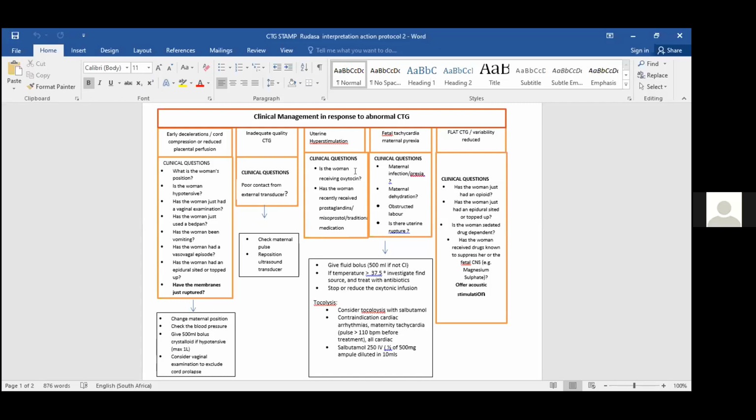Okay, and then the other frequently asked questions, things that we often discuss. People will say, okay, Dr. Mandondo, this patient has come in ethanol-induced or intoxicated. Now you think she's intoxicated and her CTG is flat. How much time do you give this CTG? You would have said 90 minutes maximum, but it remains flat after an hour or 2 hours. What do you do? There is no cutoff time where we can say no. If she's ethanol induced, and you give her the fluid bolus, she'll sober up, she'll excrete the alcohol, and therefore she will become better and the CTG will improve.